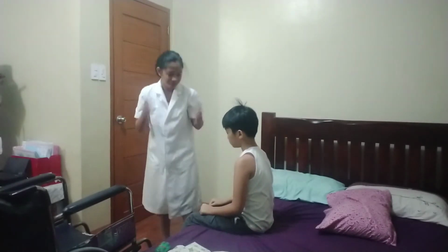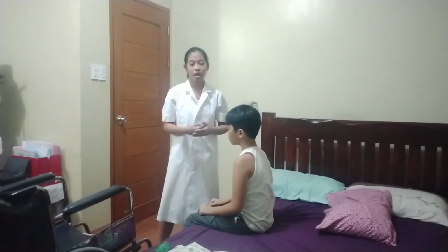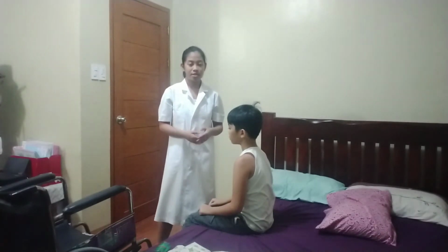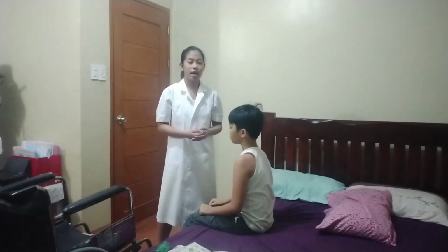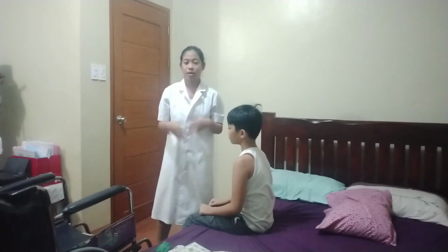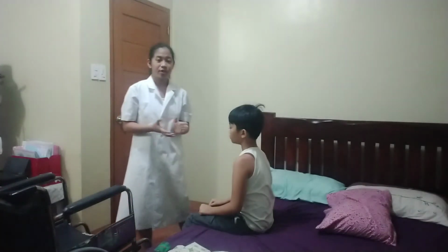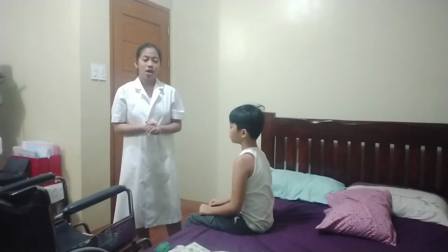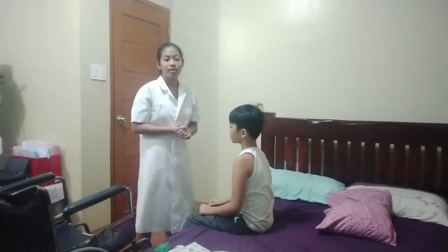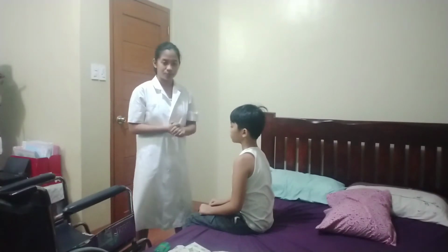Comfortable po kayo. And then after that, I will wrap the gait belt around the patient's waist based on the assessed need and per facility policy. But in my case, I will be using my arms to lift my patient. And then I will stand in front of my patient with my feet spread at shoulder width, and one foot slightly in front of the other foot.